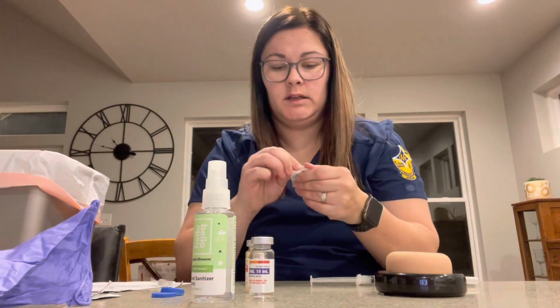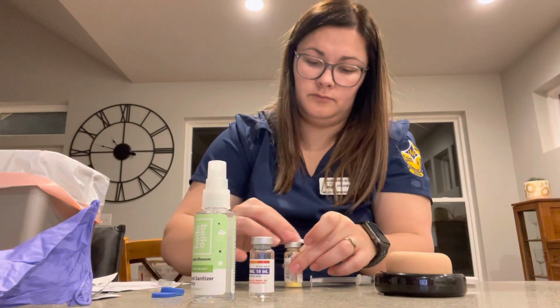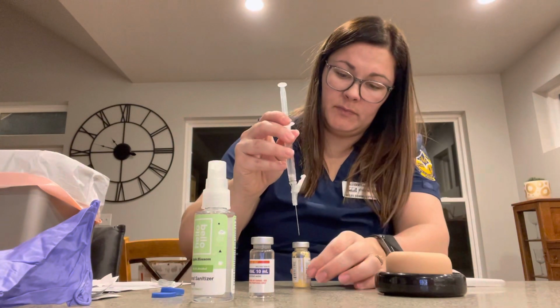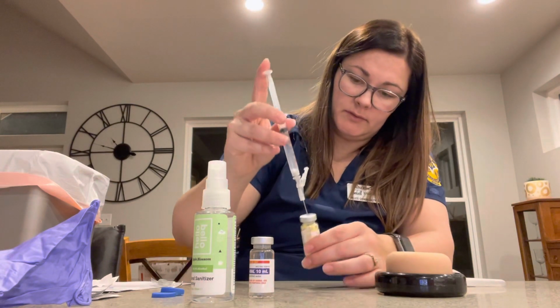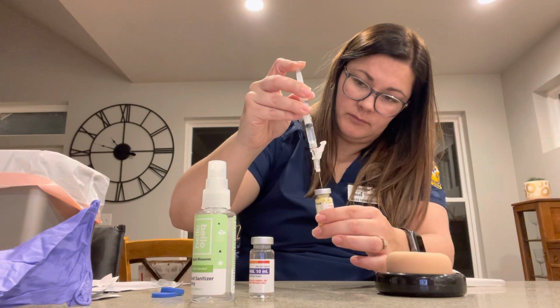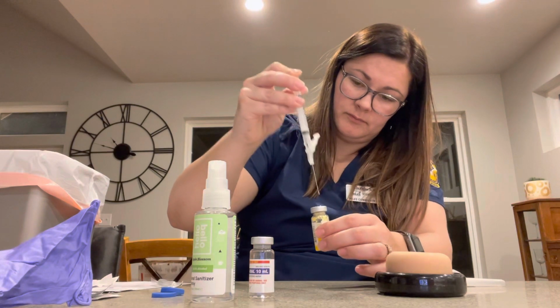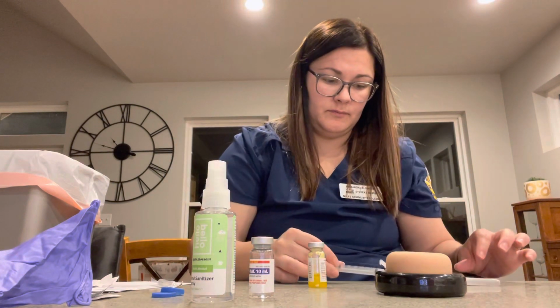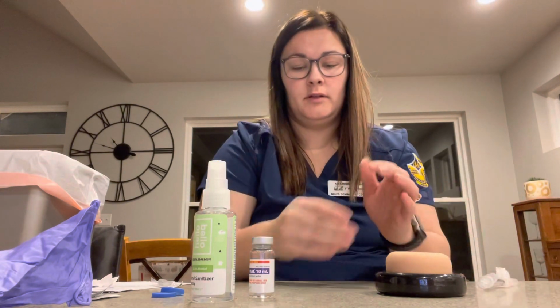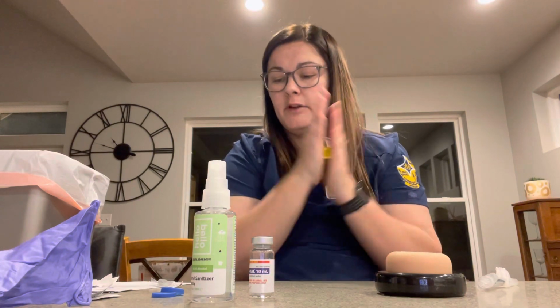I will then re-cleanse the medication vial. Uncap and add the diluent. We'll then recap and gently roll the medication between my hands, making sure not to vigorously shake.